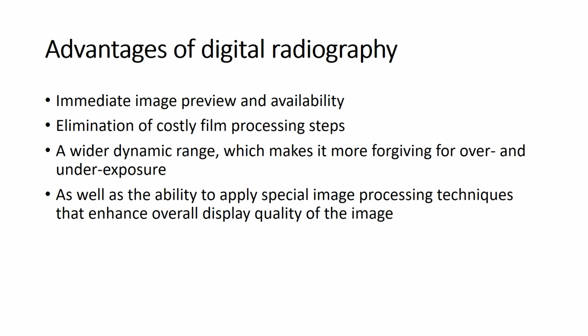So, let us discuss the advantages of digital radiography. Immediate image preview and availability is one of the major advantages of digital radiography. It eliminates the costly film processing steps.